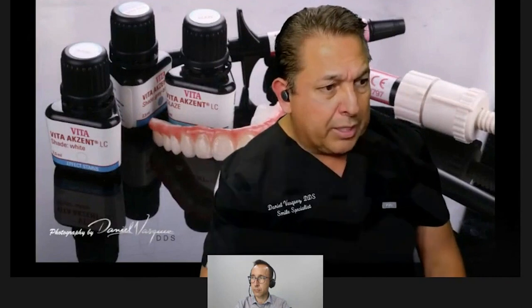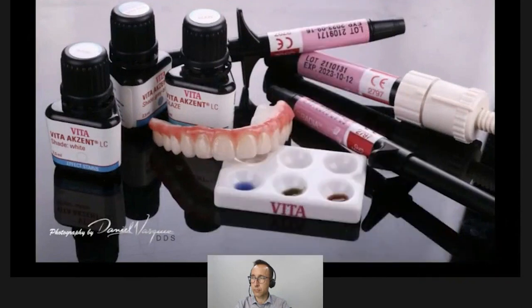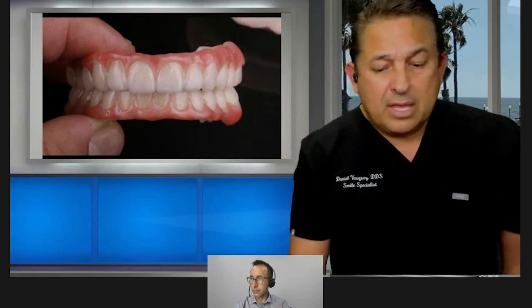Yes, we're going to stain and glaze it, okay? We're going to stain and glaze all these restorations, and everything's going to be in color. So I'm just, there you go. On this case, you can see on my screen, the bottom's still not finished. We finished the top. Those are both of them already finished right there. And this is the final result.